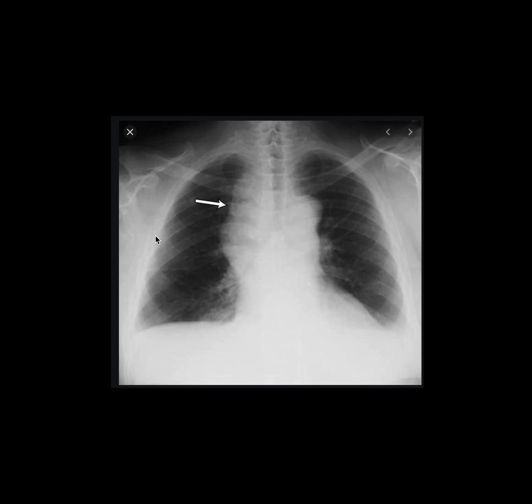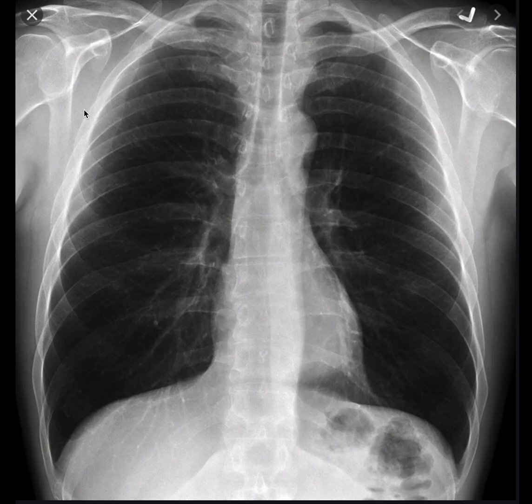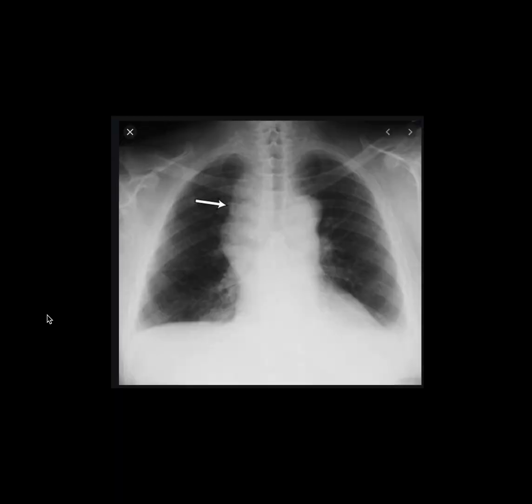As you can see here, the pleura is becoming slightly hazy — you cannot clearly see the borders compared to the normal chest X-ray. But you can still identify the pleura, which suggests the person is undergoing pleural effusion. Also, you can see that the costophrenic angle has slightly become hazy; it is not as sharp as it should be, suggesting pleural effusion.